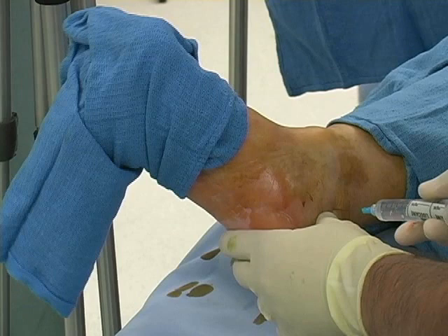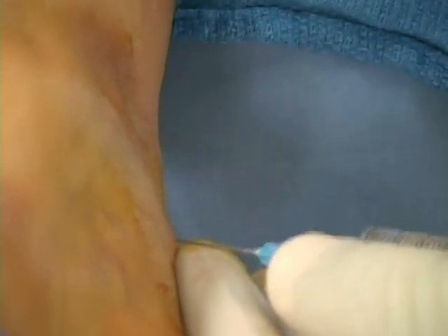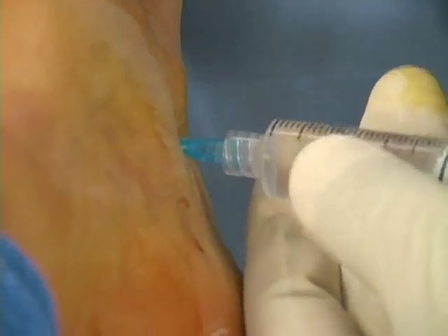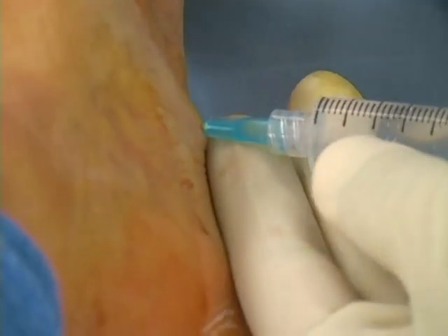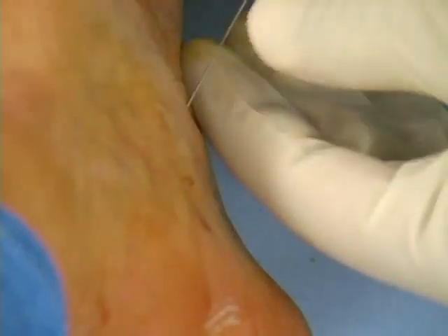Insert the needle one centimeter behind the artery. Direct the needle toward the posterior border of the tibia. Advance until the needle tip encounters bone. Withdraw the needle one-half centimeter and inject two milliliters of local anesthetic.